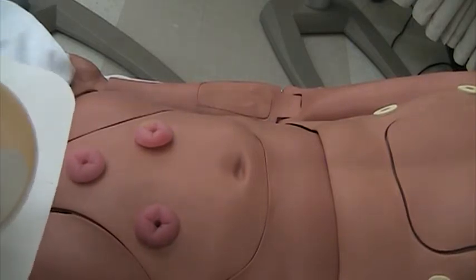It's called various things, but if you're in clinical and the instructor says go get me a stoma wafer, this is what we're talking about. When you peel this back, this is the portion that goes to the skin. It's what connects and keeps the skin clean.